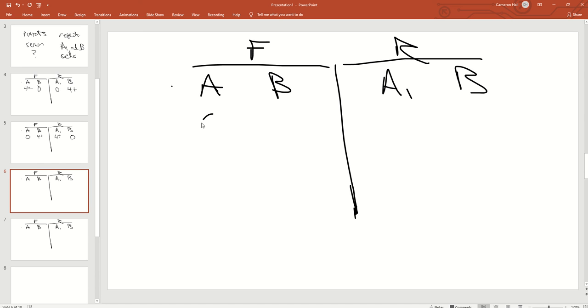Alright, so what if we see this? What are we expecting? Well, this would lead us to believe they have neither A nor B antigen on their cells. And what cell type would be representative of that? O cells. So if they're O cells, what antibodies should they have? Both anti-A and anti-B, which should react with both our control A and B cells.